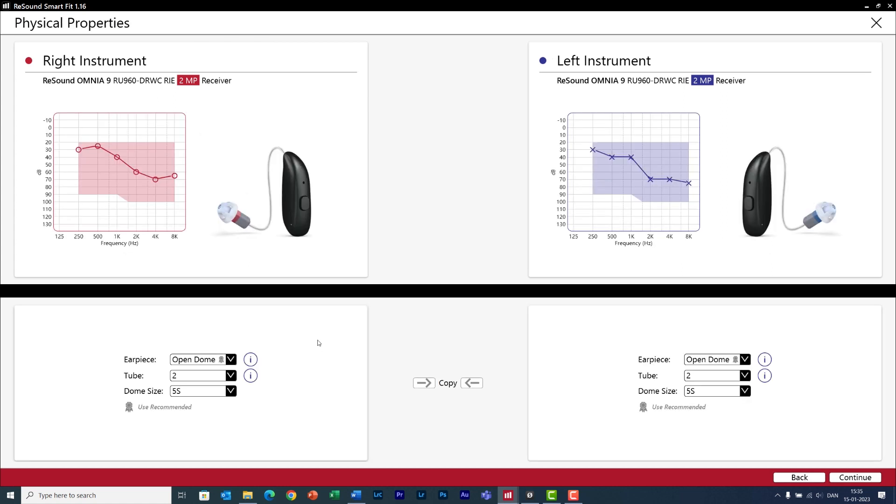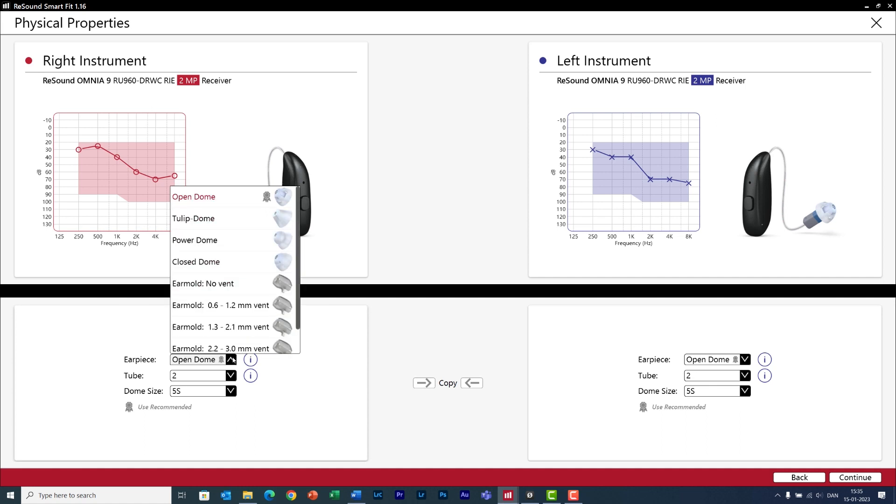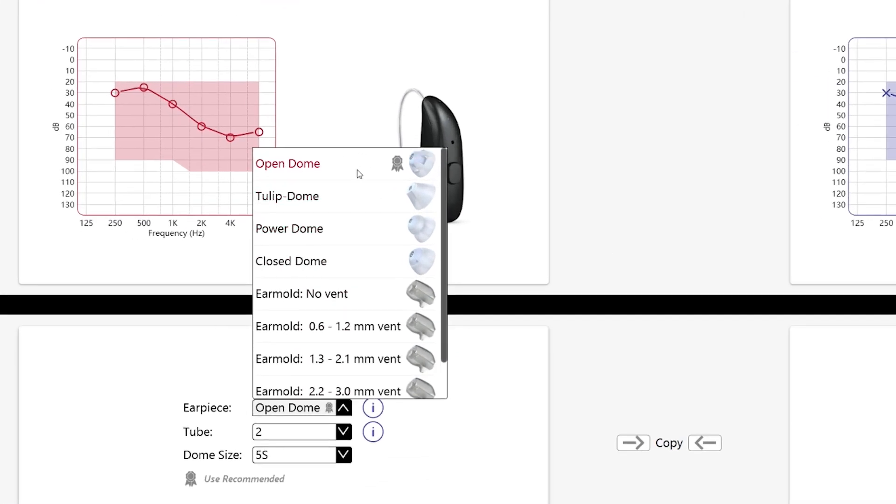This part is important. We need to tell the software which dome we want to use for this person. If in doubt the software can recommend a particular dome based on the audiogram of your client, and again it is shown with this ribbon icon.